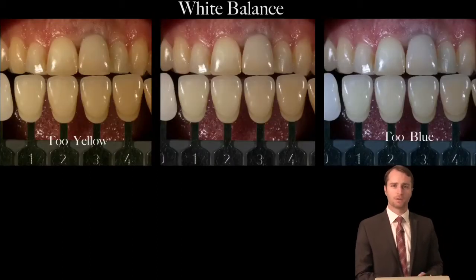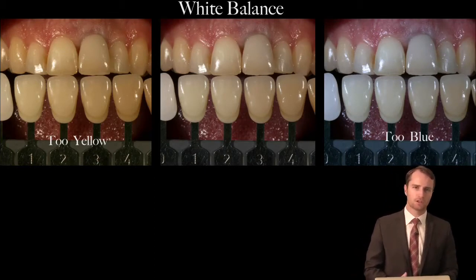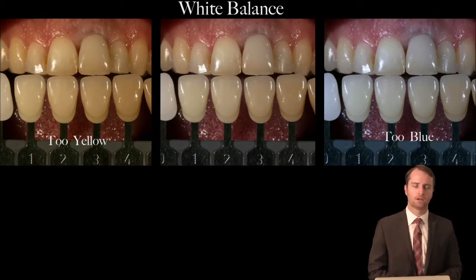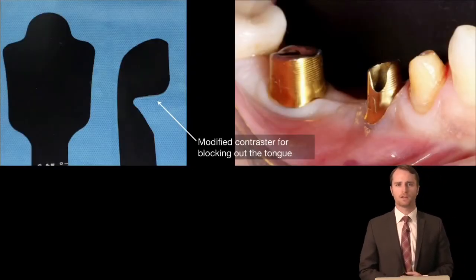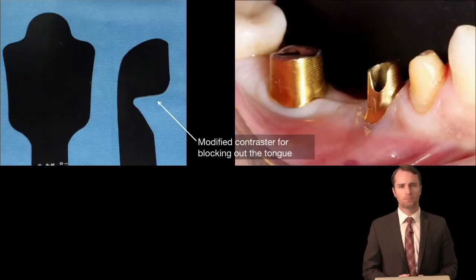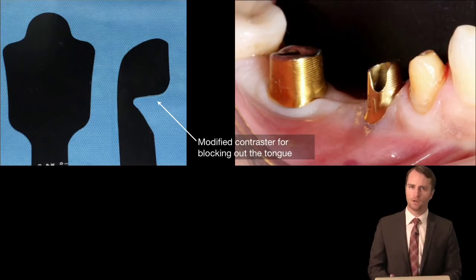We'll also talk a bit about some of the technical settings on the camera, although not in too much depth, as this is an introductory level course. I won't overwhelm you with technical details. We will go over a few minor things that will help make sure that even your initial images are very high quality. We'll talk a bit about the accessories as well that will help create images that you're very happy with. And what I've found is that high-quality images communicate high-quality dentistry. This is true in communicating with our patients and with our colleagues.